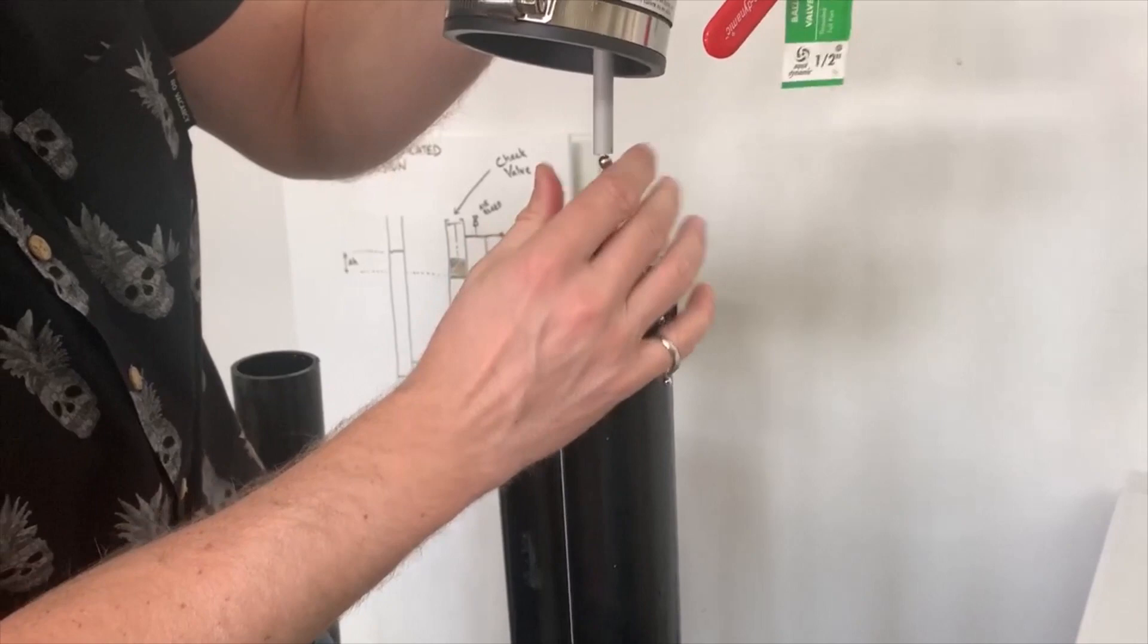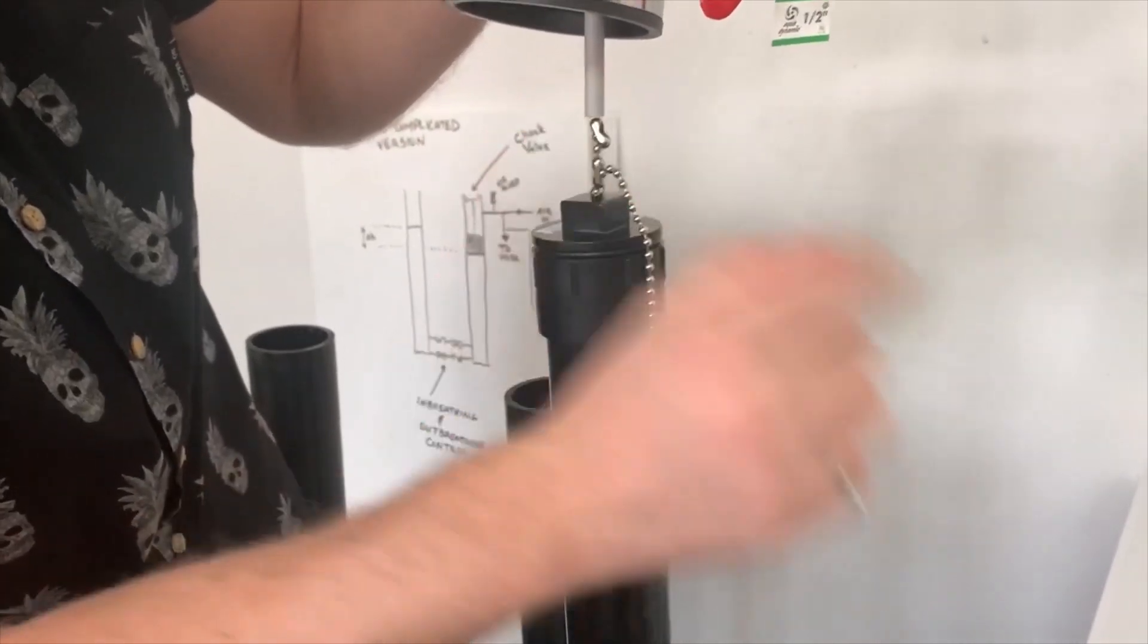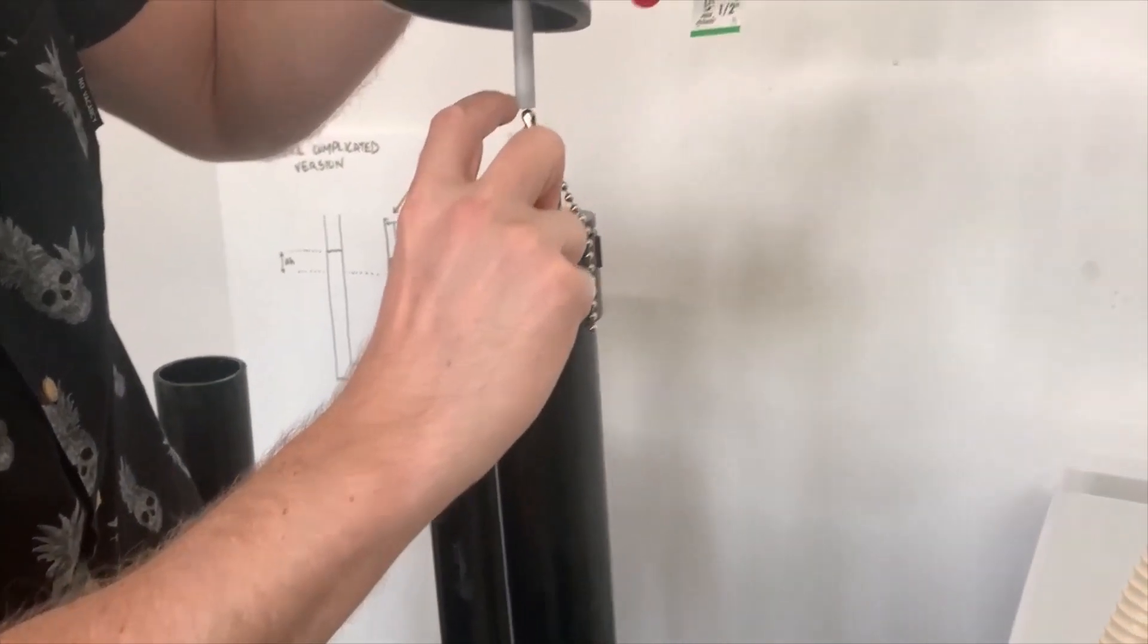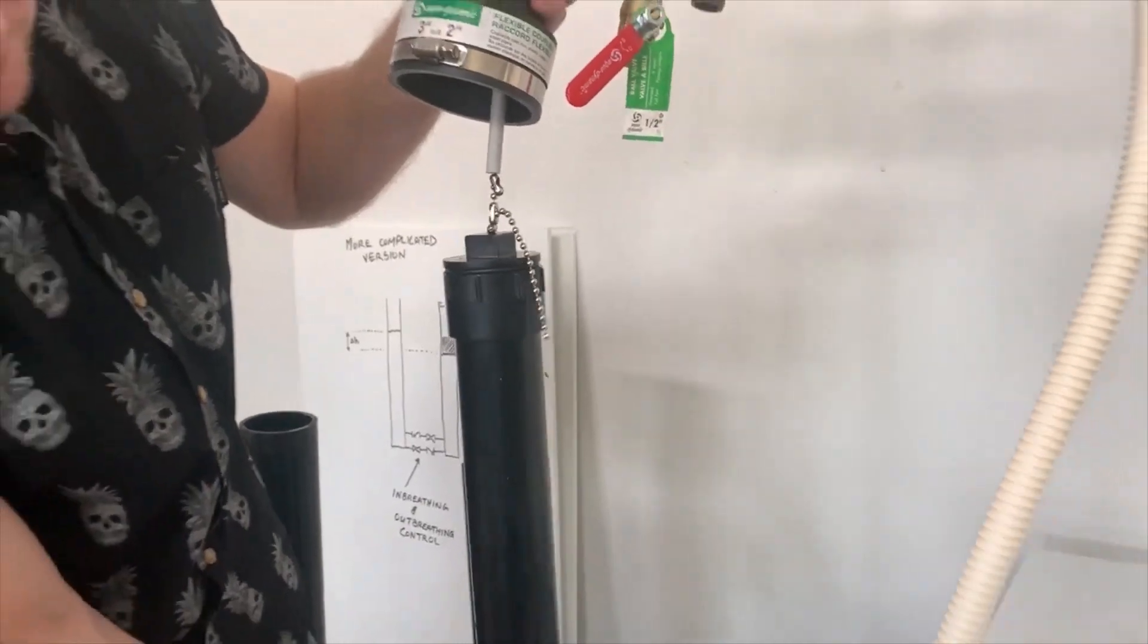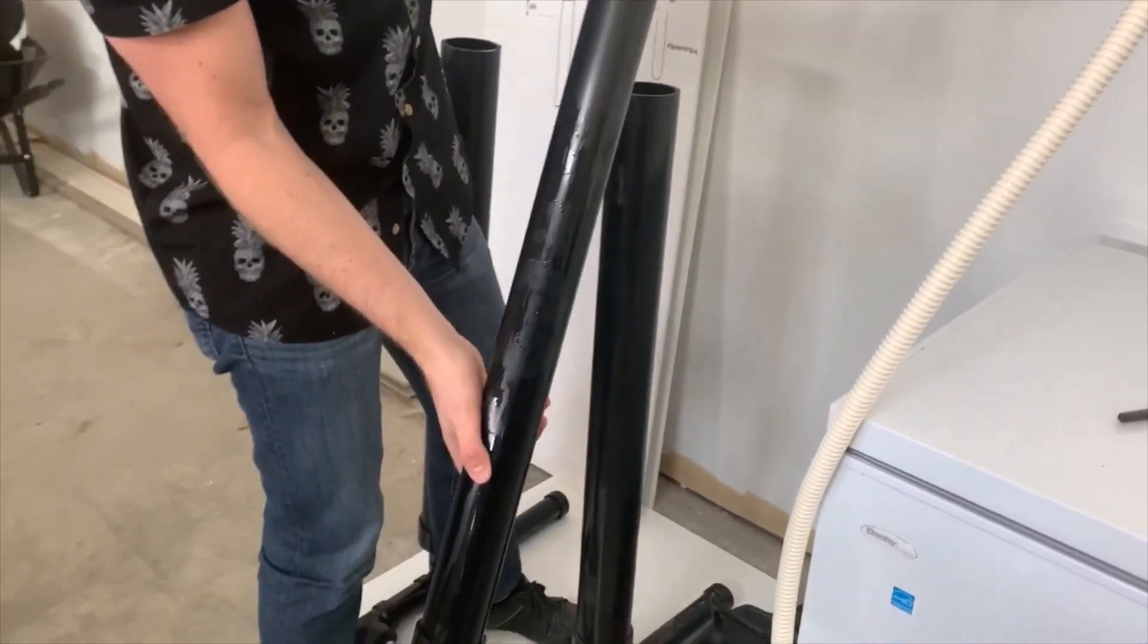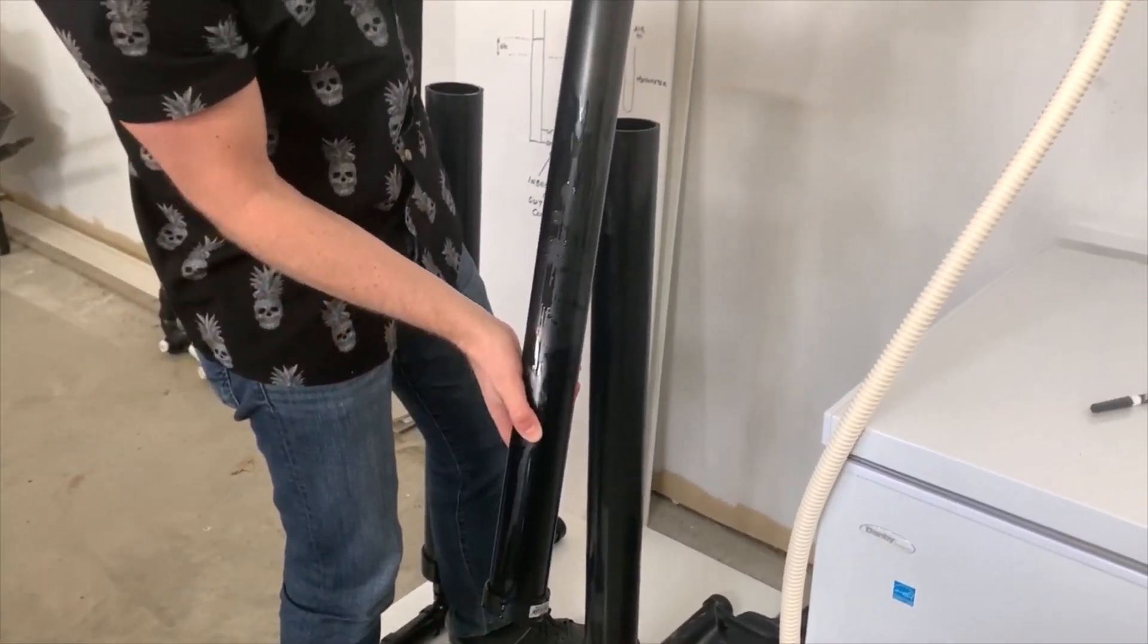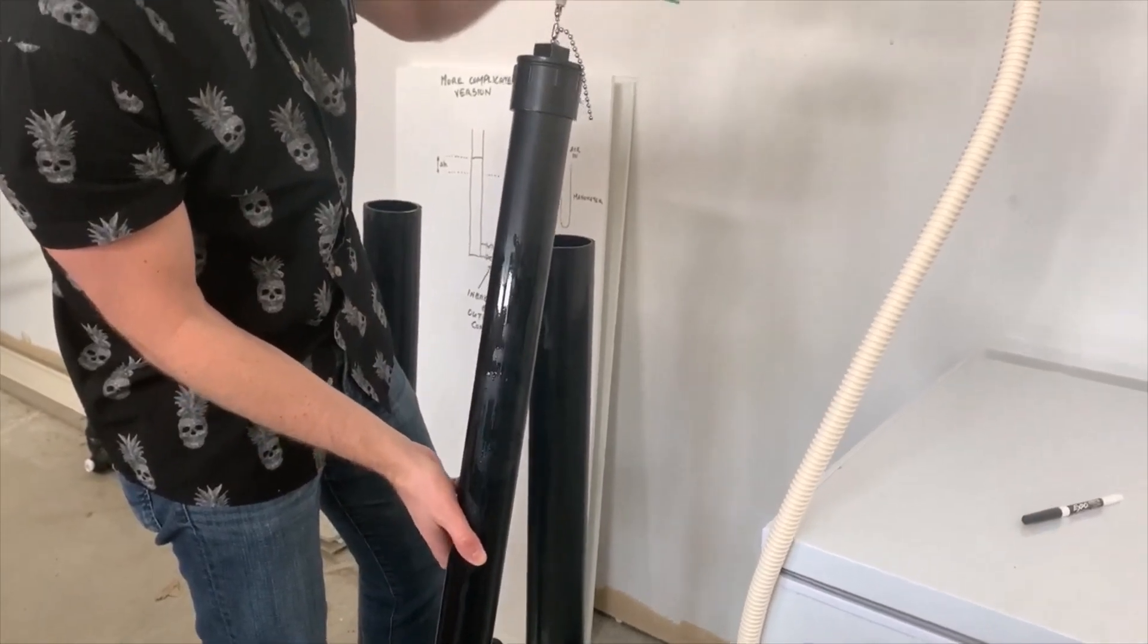If you want more pressure coming out to the mask, you can increase the length of the chain. Inside this float, I have about a pound of washers to ensure it pulls the valve open on every stroke.